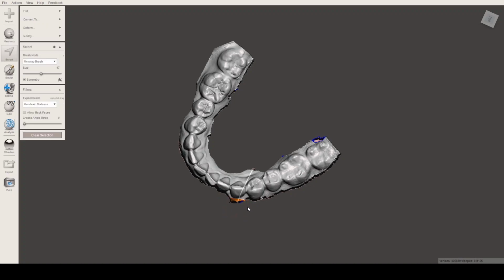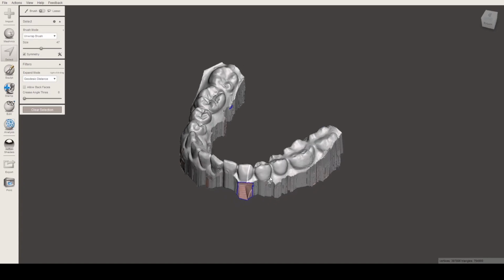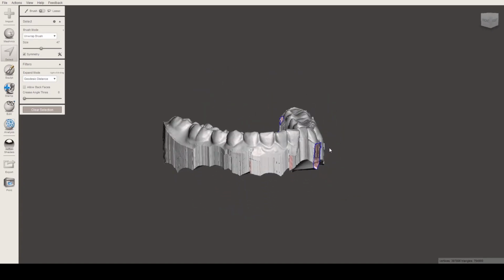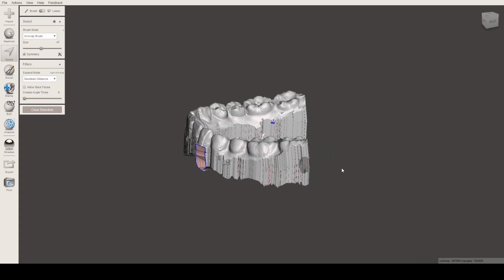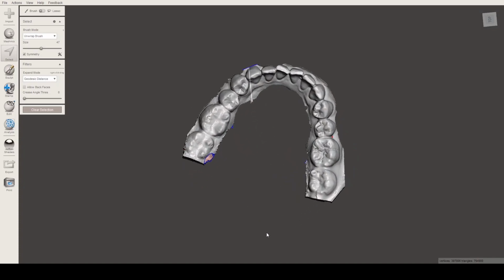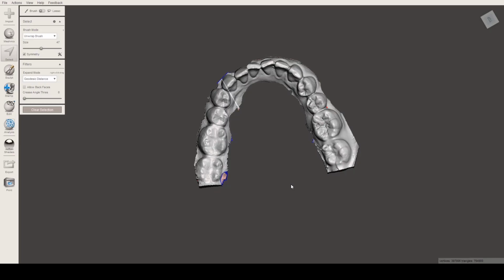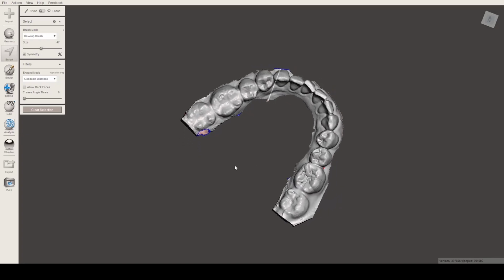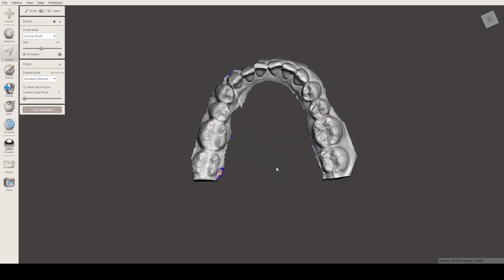Let's delete this as well. Let's make it smooth. It'll probably make a hole, but that's my purpose of it. I'll fill up that hole later on. This is just for demonstration, guys. I'm not gonna be anatomical about the teeth. I'm not a dentist. But the purpose of this video is to show you the software itself. Oops, sorry about that. That was my alarm.